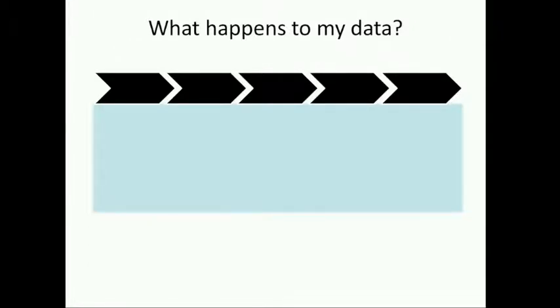In addition, those data will then get pushed onto a central server. Right now they're getting pushed to Minerva, and I think that's probably the way that's going to proceed. So Minerva, in addition to being a supercomputer and allowing you to manipulate your data, will also allow you to access those pre-processed data and take them off and do whatever you like with them. And over time, we'll develop this more, so there may be more things available to you, like even some automated analyses might get run on your data in the future.